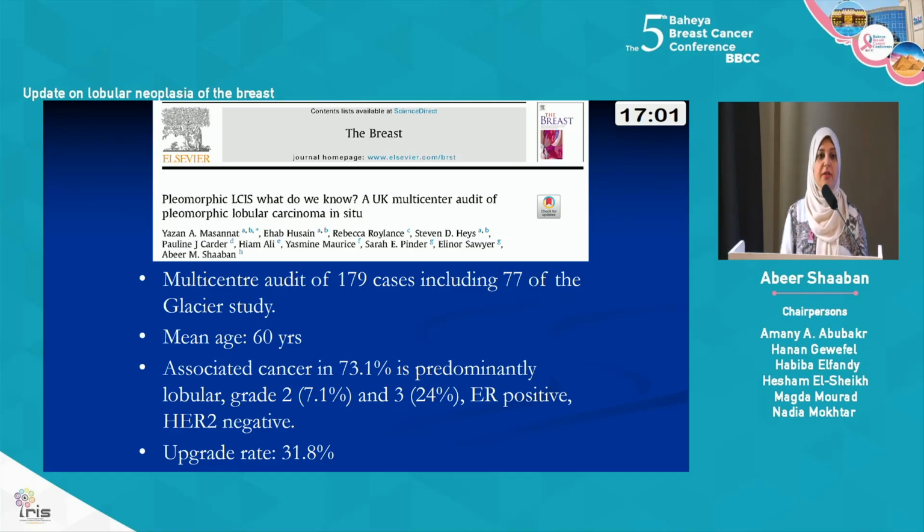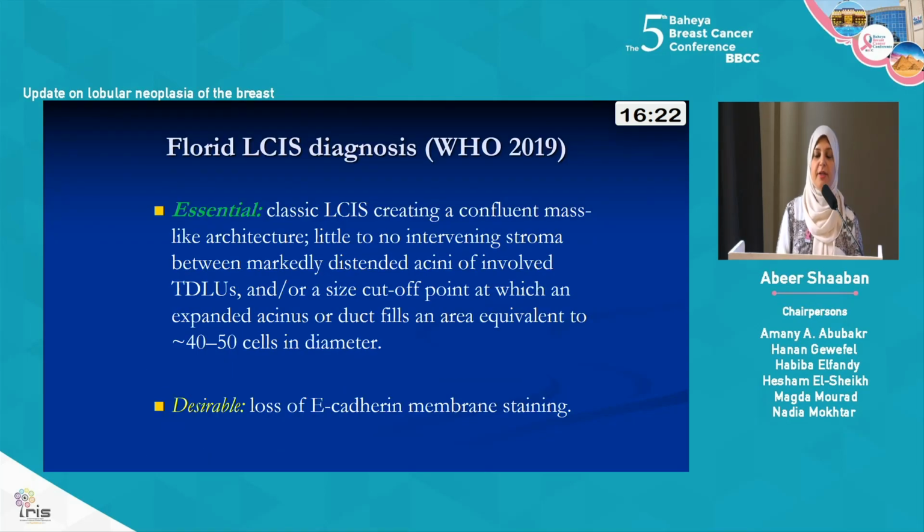The associated cancers were predominantly lobular, and a small proportion were grade 3 and ER, mostly were ER positive, HER2 negative. If you have pleomorphic LCIS in core biopsy, when we did further tissue examination, we upgraded to invasive malignancy in almost a third of the cases. So this is in situ disease, and once we diagnose it on core, we need to excise. It's B5A, okay? So classic is B3, PLCIS is B5A, managed by complete excision as per high-grade DCIS.